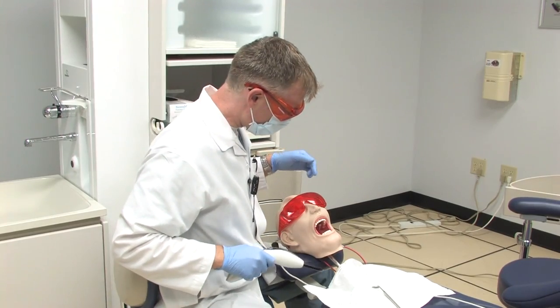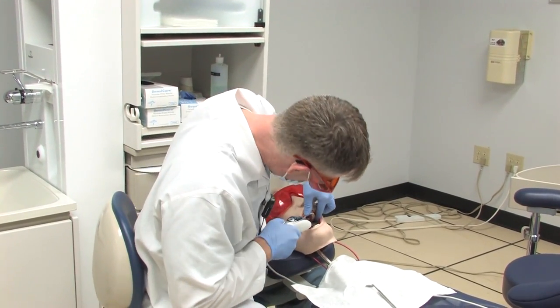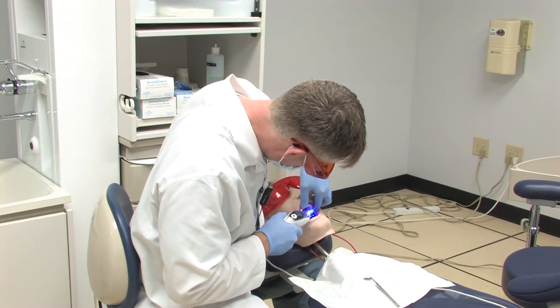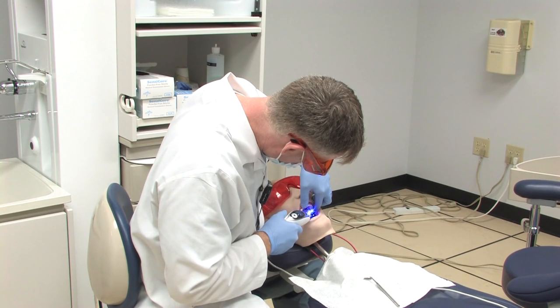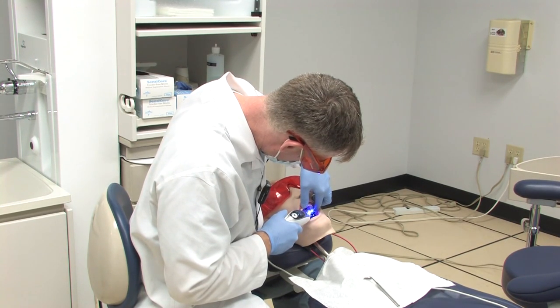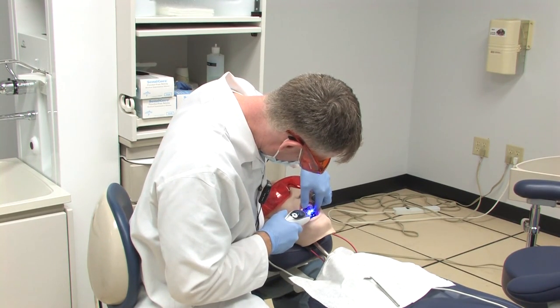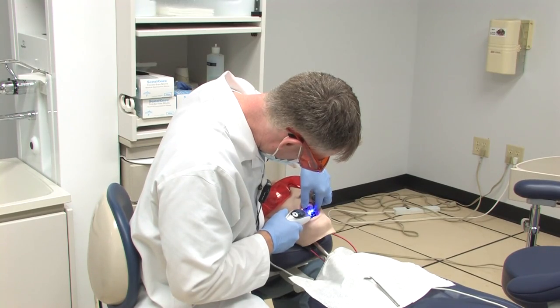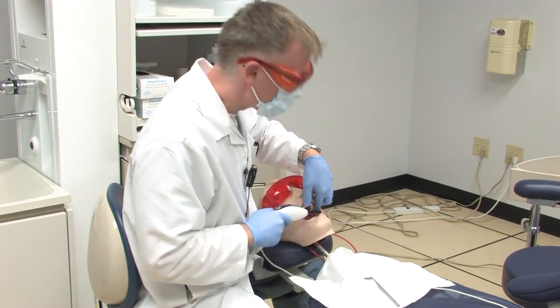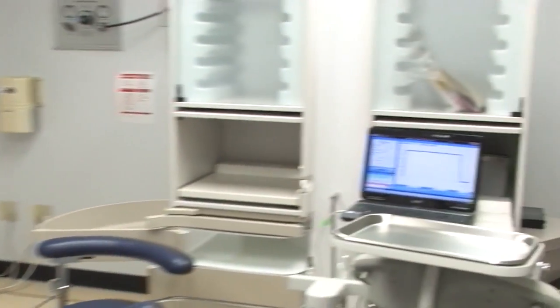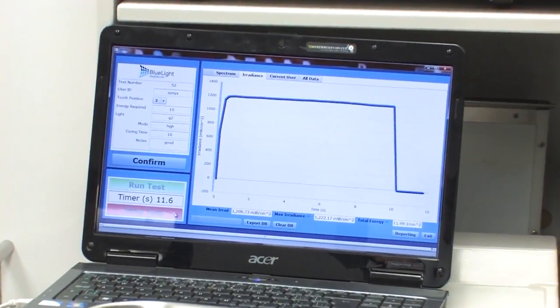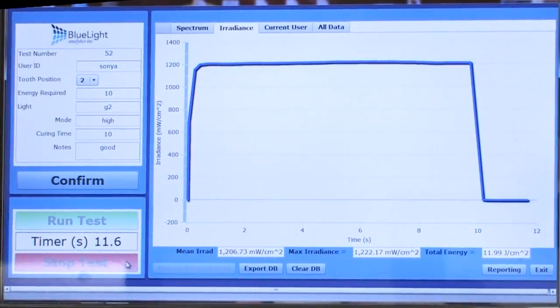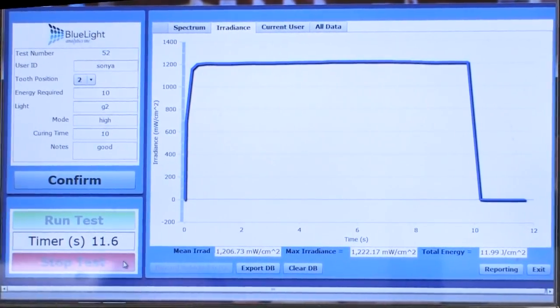Okay, Mrs. Johns, we're just going to cure that filling for you now. Here we see that he delivered 12 joules of energy.